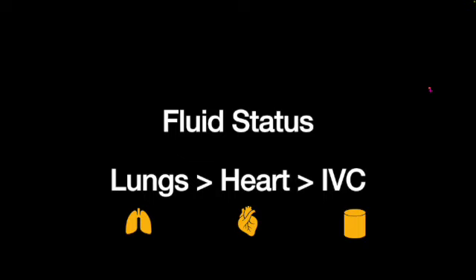Fluid status, just like with undifferentiated dyspnea, I start with the lungs, I look at the heart, and then the IVC. Lungs, I want to know, are they wet or dry? If they have wet lungs, I'm not giving them more fluid.